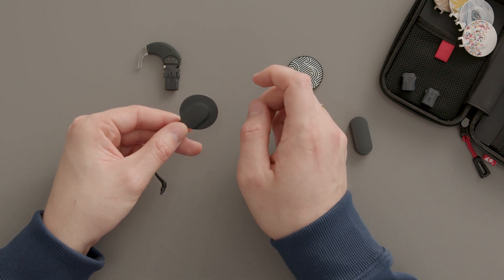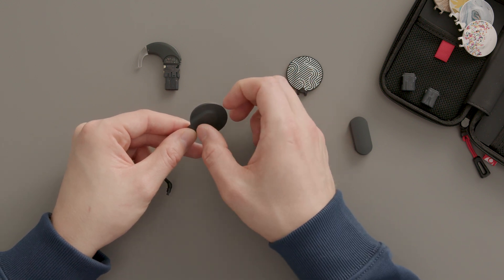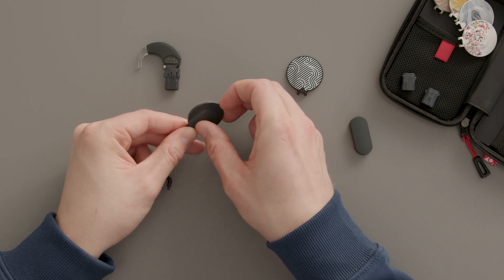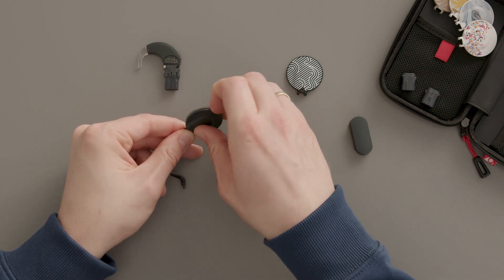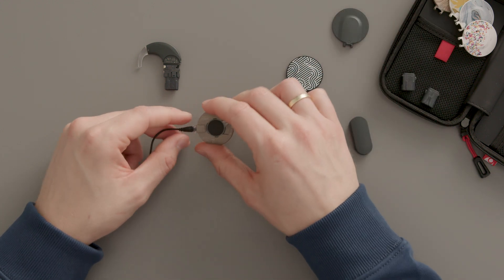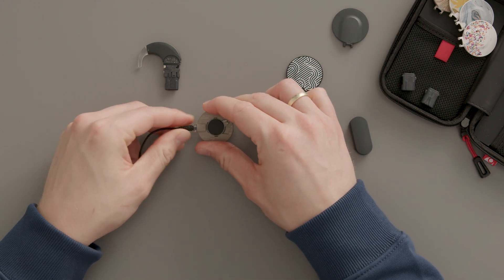Insert a fingernail or plastic screwdriver into the small recess on the opposite side and slide it around the base. A click will indicate that the cover is open. Peel the cover off, lifting up from the side with the recess.